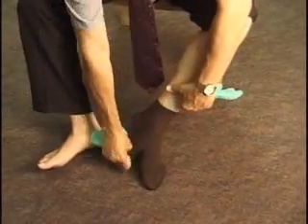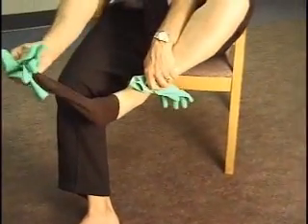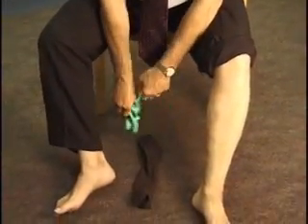Removal of the stockings can be done by the reversal of this process, again with the gloves forward and aft on the foot, greatly facilitating this process.